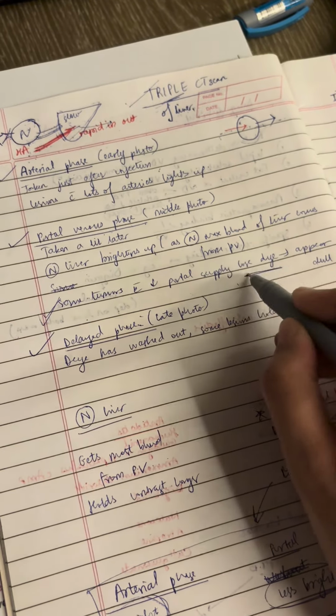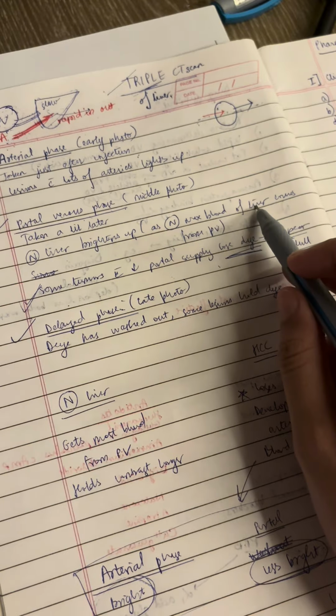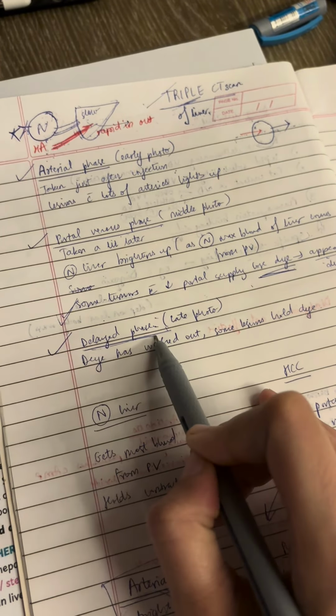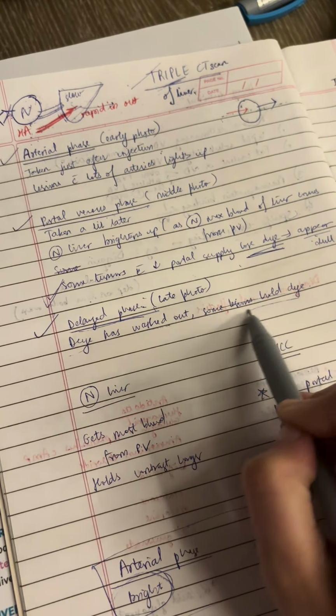Here it's very important, okay? In this phase, they will appear dull as compared to the normal liver, which is brightening up in this phase. Then the third photo that we take is the delayed phase. The dye has completely washed out, but some lesions will hold the dye.